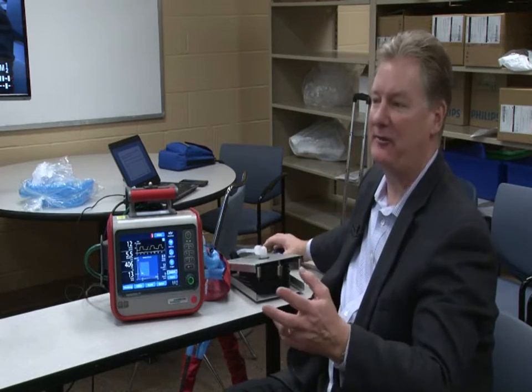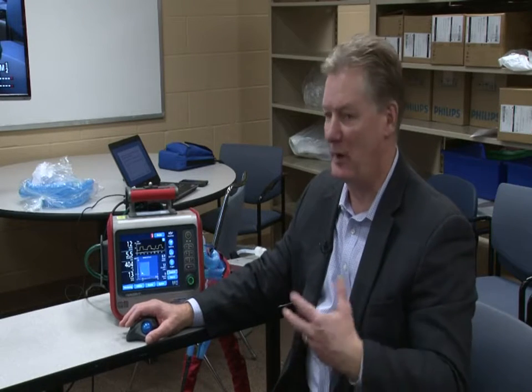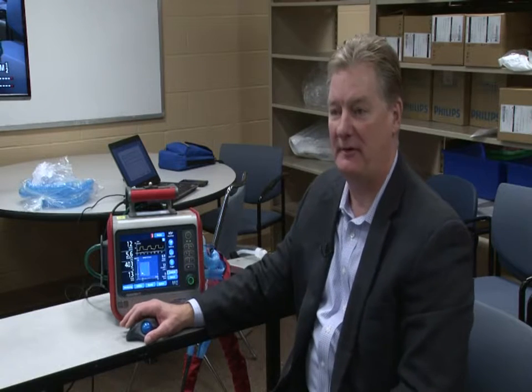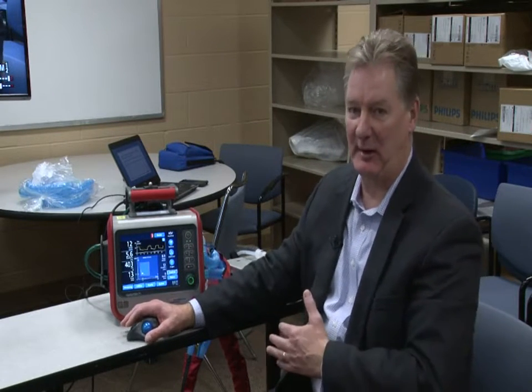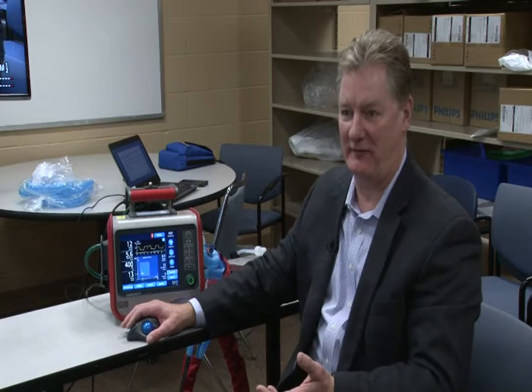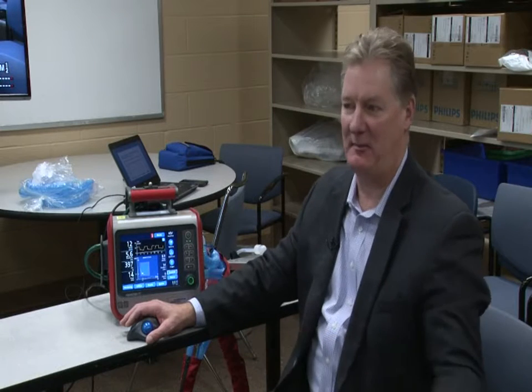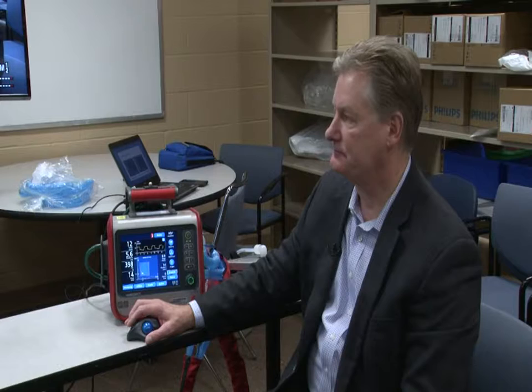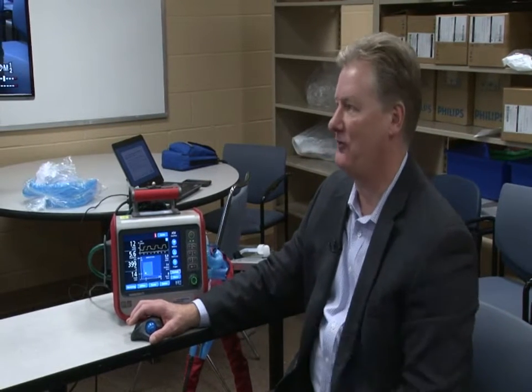I guess the operative thing is any patient that has an excessive drive for whatever reason, unless you're going to sedate them, probably should not be used on ASV, because what will happen is that drive will be interpreted by ASV as the patient wants to wean off the ventilator, and the ventilator will wean support, and you'll have a patient intubated on the ventilator, and the patient will be doing all the work. So probably not a good thing. Could you do it? You could, but you're on the wrong side of the efficiency curve.